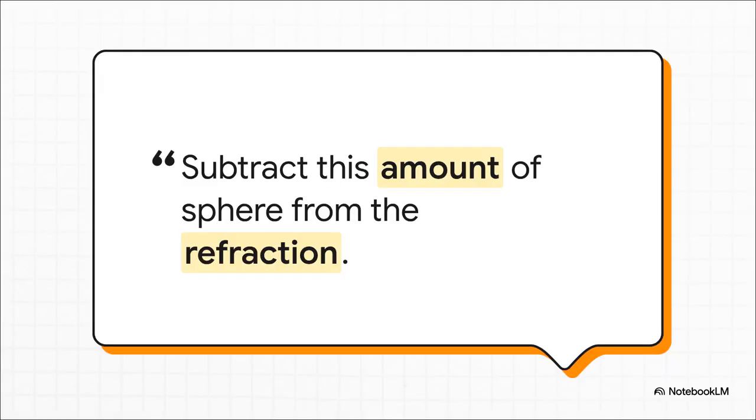I need you to write this OCAP Pearl down in huge, bold letters. Always subtract your working distance from the final retinoscopy sphere. If you forget this step, you fail the clinical refraction and you're absolutely going to get the board question wrong. It is the mandatory bridge between the artificial optics of the exam room and the actual visual needs of your patient in the real world.